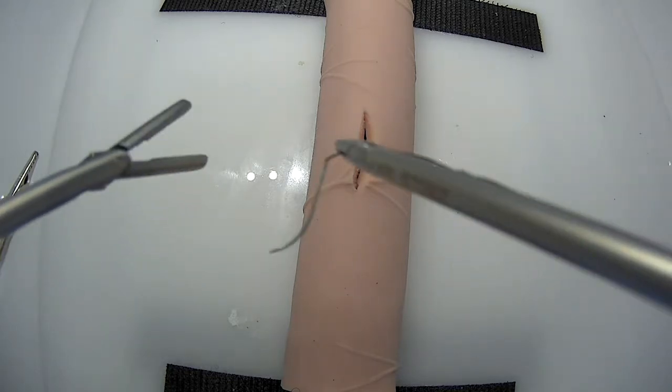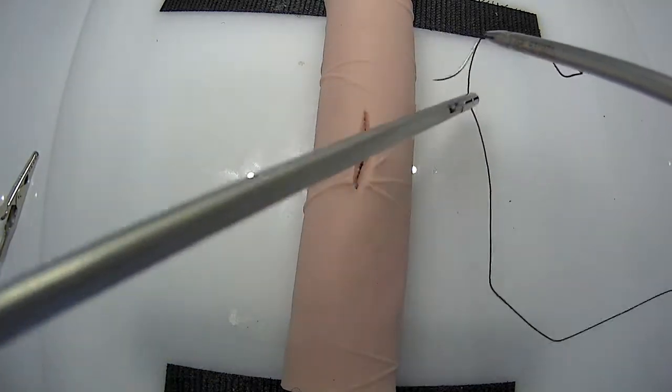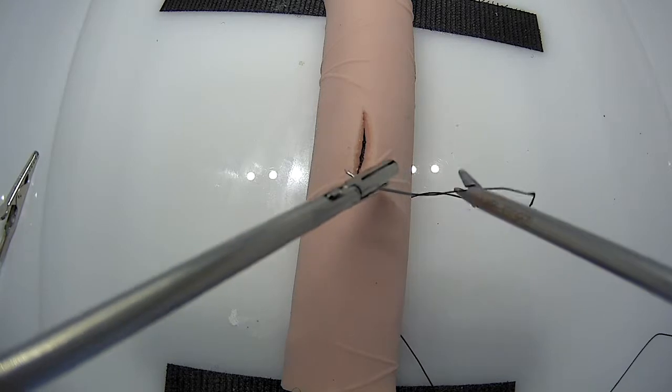Next, we'll take a 12-inch suture. You want to make sure to get the entire suture into the trainer before you start. Going to load your needle.